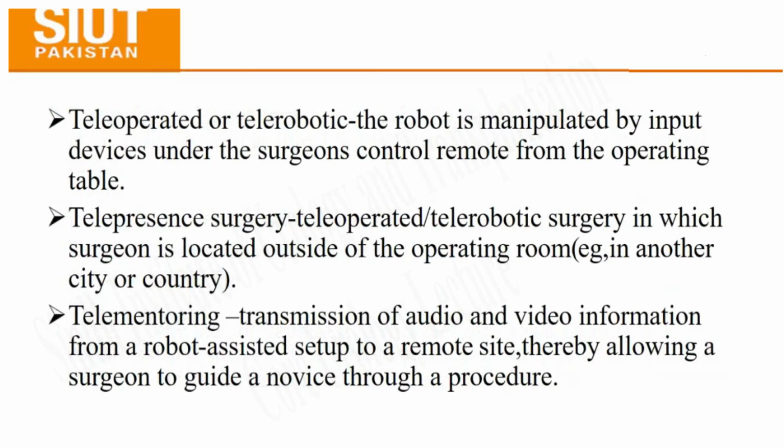The teleoperated or telerobotic, the robot is manipulated by input devices under the surgeon control room from the operating table. Telepresence surgery, the teleoperated telerobotic surgery in which robot surgeon is located outside the operating room in other country or another city and directed the surgery from a remote place.